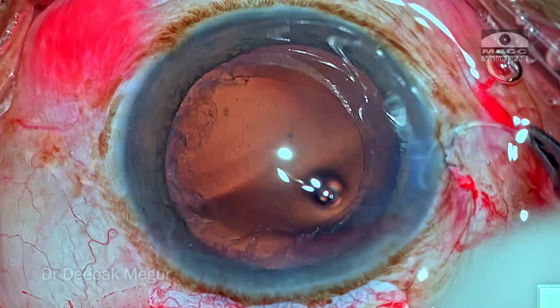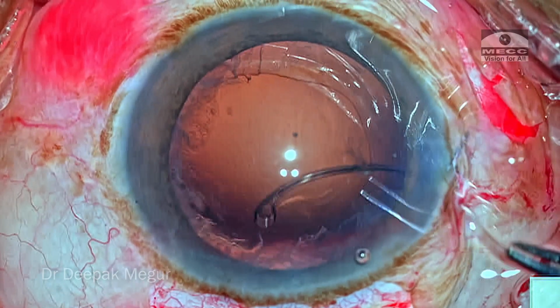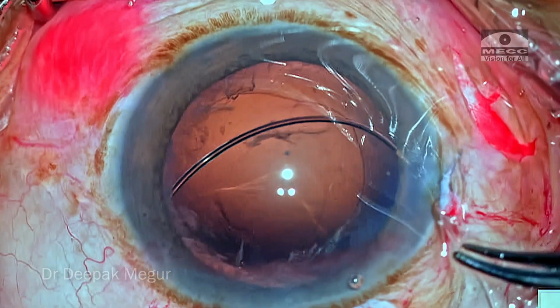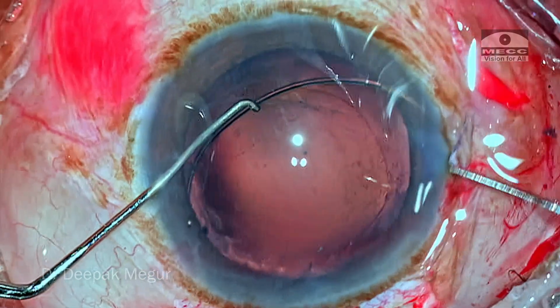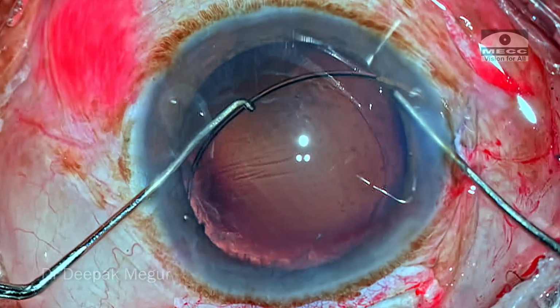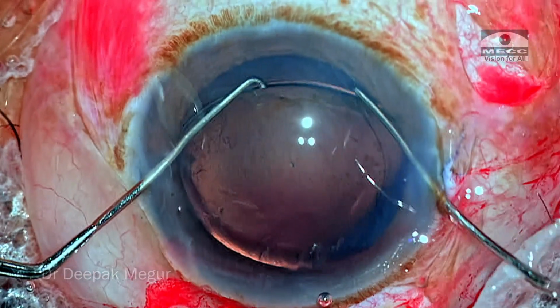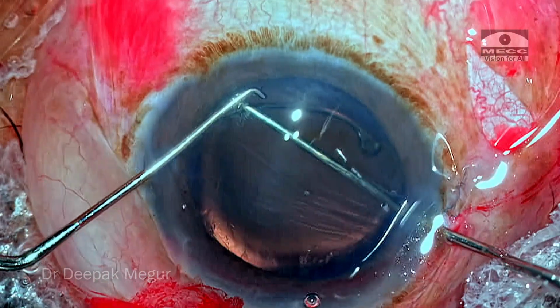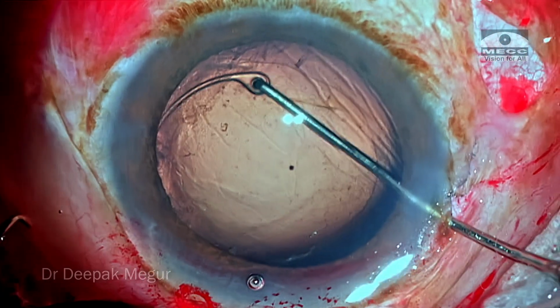So the message from this case is, you have to practice using a CTR. The beginner surgeon, as we saw, has to get used to the consistency of the ring, the way it feels in the hand. It's not a matter of how many videos you see. You have to use them in your practice to actually get used to the consistency, the feel, and the difficulties you face. So my recommendation would be, try to use at least 10 CTRs in routine cases. This is where you get to know the feel and the consistency of the CTR and what difficulties you're going to face.